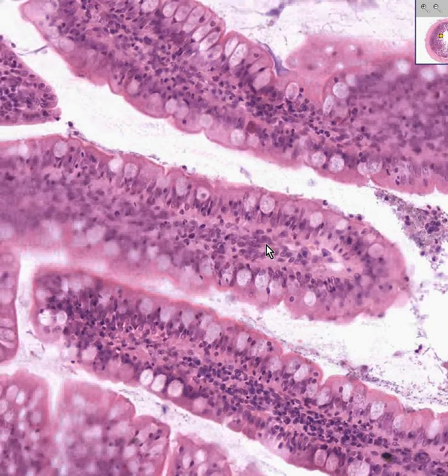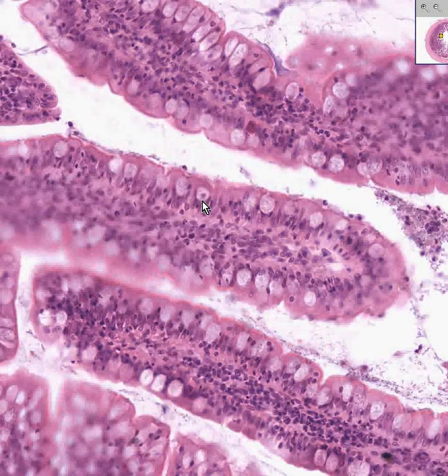So here is a goblet cell of the epithelium of the mucosa. Here are some absorptive cells. Here's the lamina propria. Here are the various connective tissue and lymphoid cells of the lamina propria, such as macrophages, lymphocytes, and plasma cells. Here perhaps is a small blood vessel or lacteal.